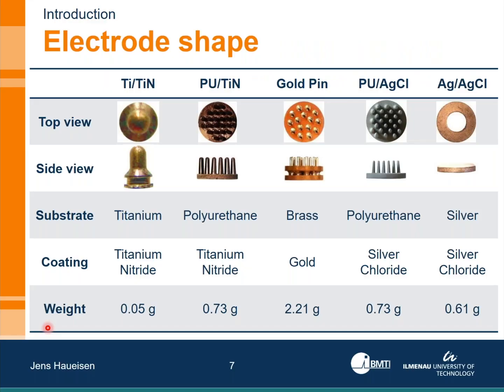Now, having worked on this field for a long while, we have tested many different types of electrode materials and many different shapes of electrodes and so on. And I would like to give you in this slide a short overview on what type of electrodes you might think of, or you might have been using already. And the first thing to observe up here is that we have different materials.